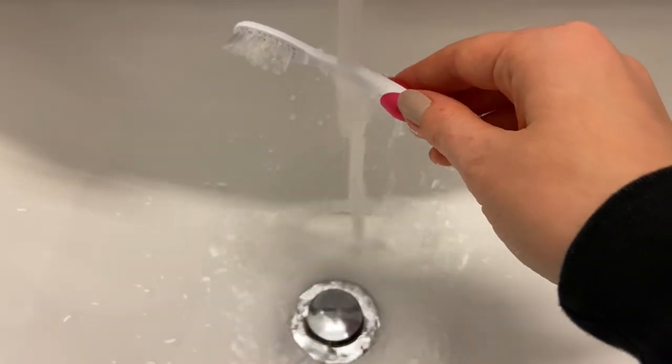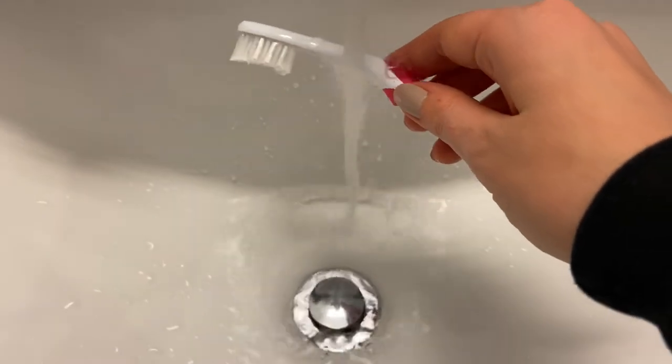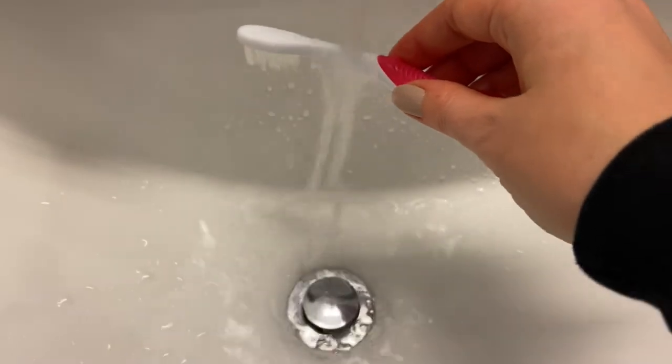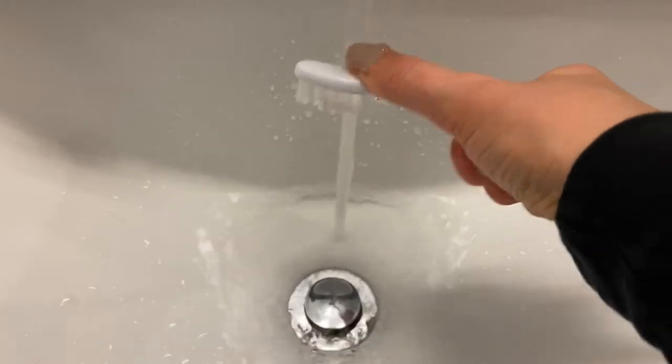You can also run your toothbrush handle under hot water for about a minute or two, depending on how hot your water is — just be careful not to burn yourself. Then bend it as much as you can so it's at a different angle. You might want to test with your arm and how you can move it before bending it under the water, just so you know what angle you want. I really hope the information in this video has helped you modify your toothbrush to make brushing easier. Hope you have a great day!